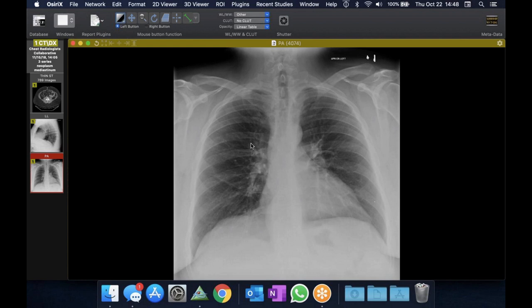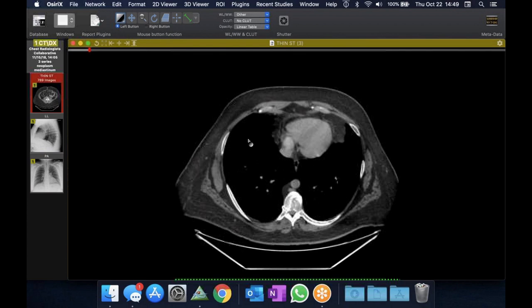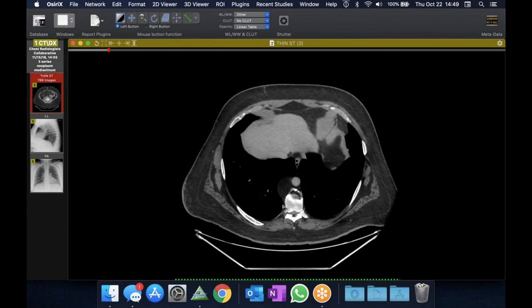This one's more along the right paravertebral or esophageal, somewhere in there. Yeah, there you go. There's an extra bump here. So in this area, you think of a paraspinal lesion, a neurogenic tumor. It's really smooth. Maybe something vascular back there. So this is something we don't see very often, but very simple explanation. It's just a nice lipoma here, sort of paraspinal.